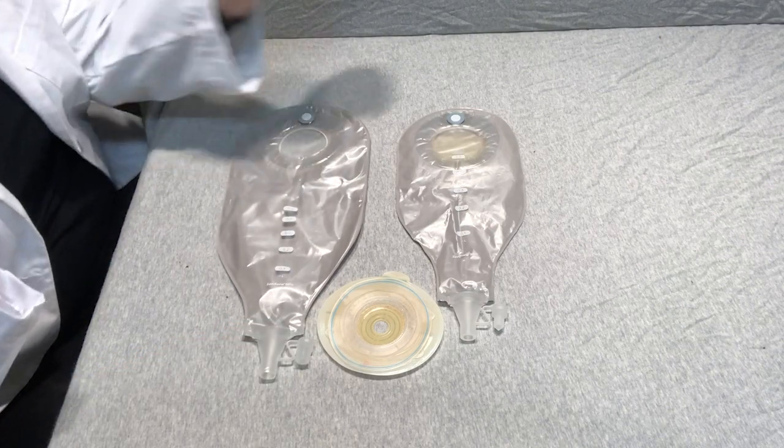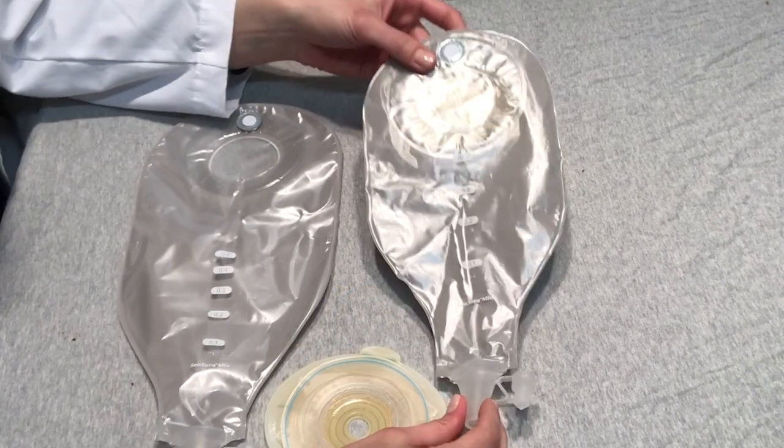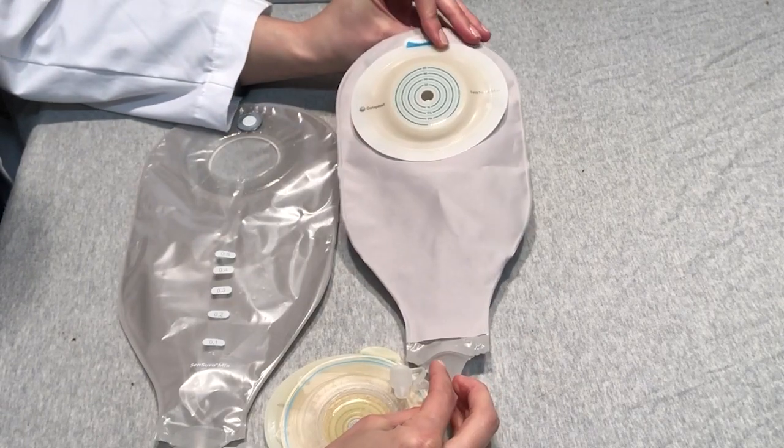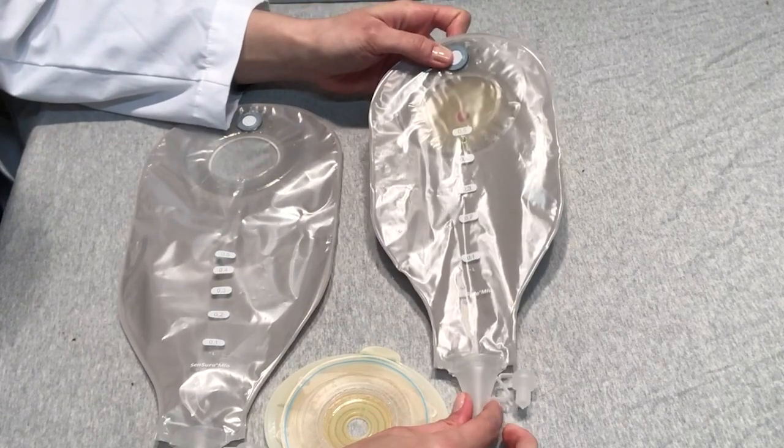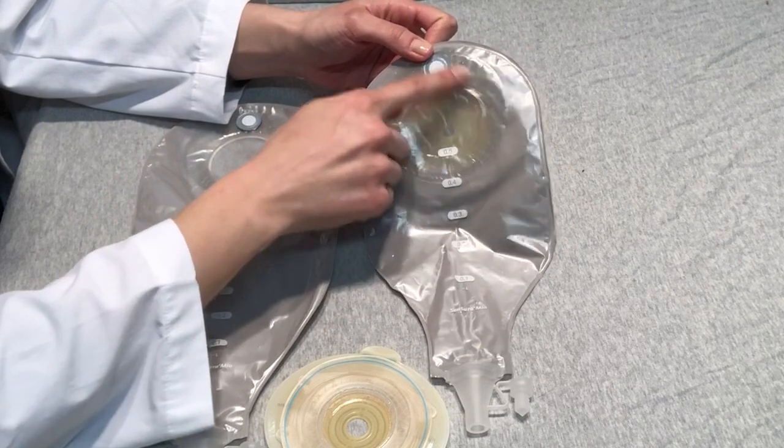So I'm going to go over the features of each one. The first one again we have our one-piece convex pouch here that's high output. We have the filter here.